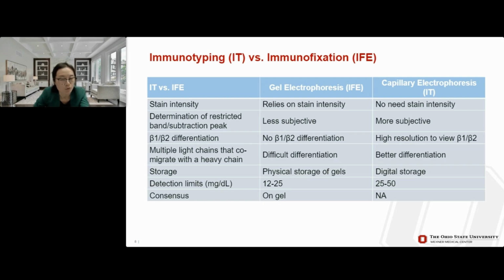I have introduced the 2014 IMWG consensus in the previous slides. However, this consensus was from data on gel electrophoresis, but not on capillary electrophoresis. Even though the analytical sensitivity of capillary electrophoresis still meets the IMWG consensus for diagnosis of myeloma with a cutoff at 3 grams per deciliter.